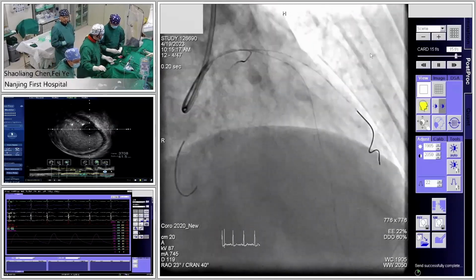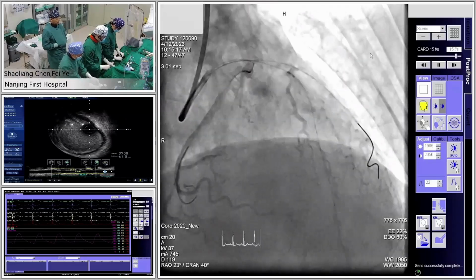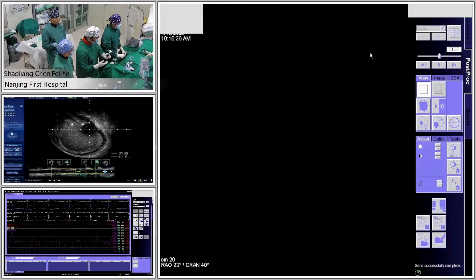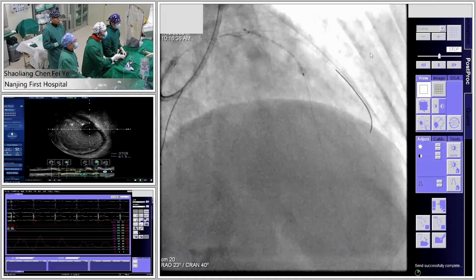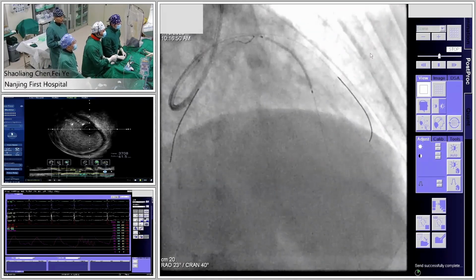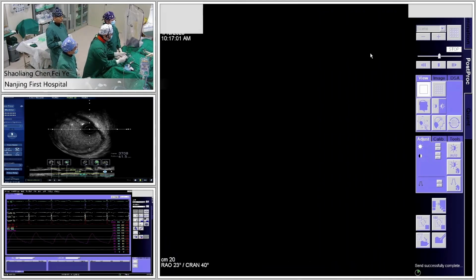This stent is a Chinese domestic stent by Microport. It has a specific technique for drug coating, which means the whole stent is not fully coated by sirolimus. There are multiple reservoirs, and also a biodegradable polymer on the surface of the reservoirs. In China, we have finished several clinical trials, and one large trial was reported in Lancet a few years ago. Another US-based clinical trial has just finished, so probably this year or next year they will report the one-year follow-up result.